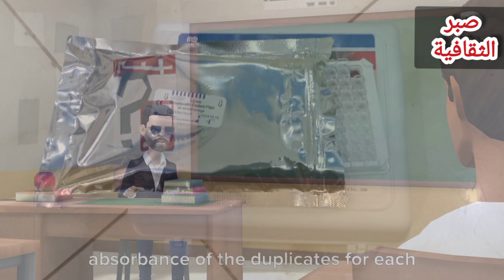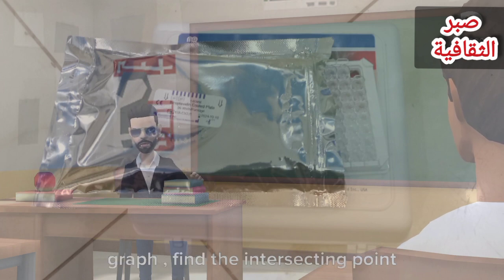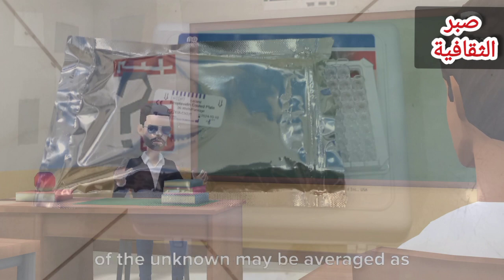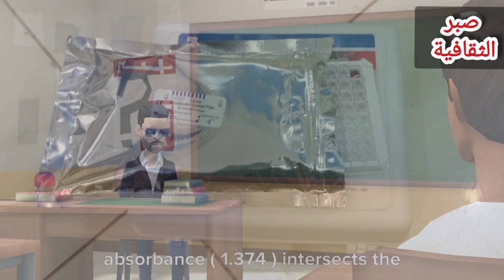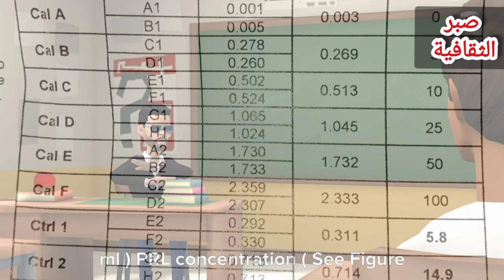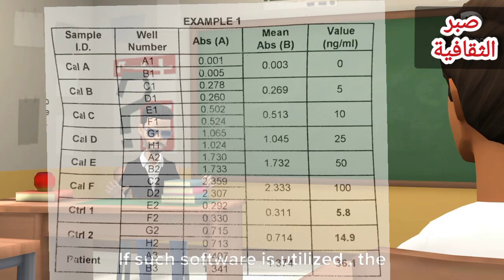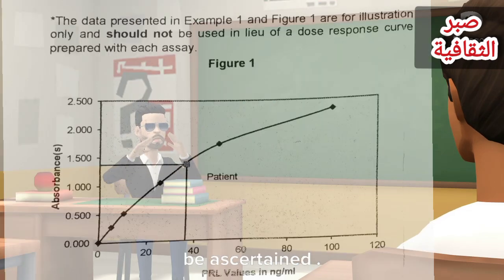To determine the concentration of PRL for an unknown, locate the average absorbance of the duplicates for each unknown on the vertical axis of the graph, find the intersecting point on the curve, and read the concentration from the horizontal axis of the graph. The duplicates of the unknown may be averaged as indicated. In the following example, the average absorbance 1.374 intersects the dose-response curve at 36.1 ng/milliliter PRL concentration, see Figure 1. Note: computer data reduction software designed for ELISA assays may also be used for the data reduction. If such software is utilized, the validation of the software should be ascertained.